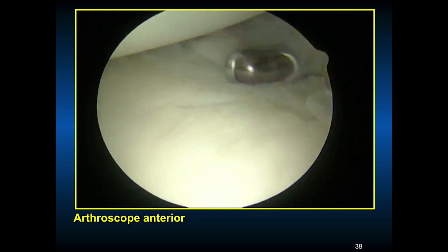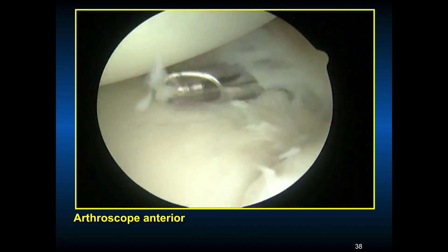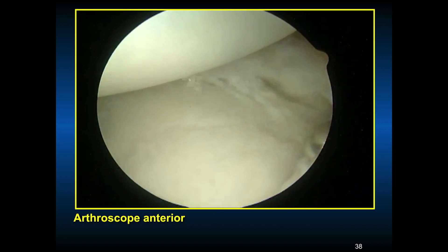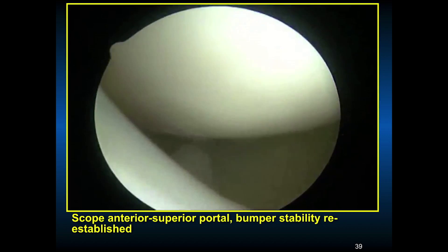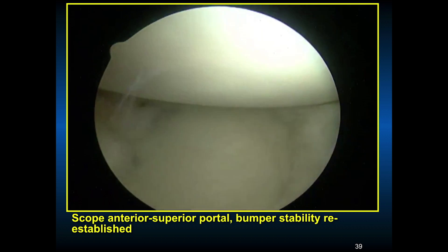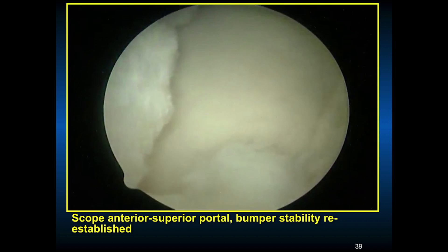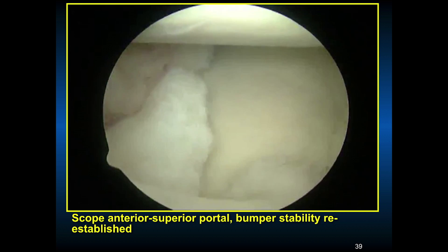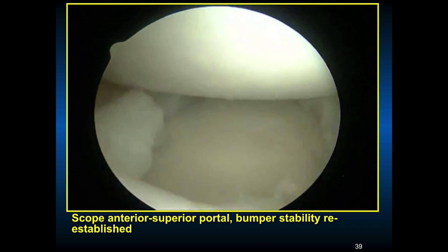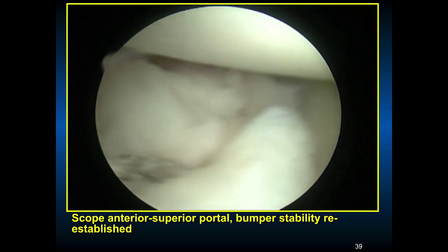Unfortunately, this individual had been a shoulder abuser — kept doing a lot of sports for many years, probably had problems for over 10 years and he's only 24. You give him the best shoulder you can, but it won't be normal. Showing with the scope in the anterior superior portal, the bumper stability of our anterior repair — you can see how we've advanced the tissues over the lip of the glenoid. With those suture anchors and two sutures in each anchor, stability is re-established, with no translation of the humeral head anteriorly after the arthroscopic repair.